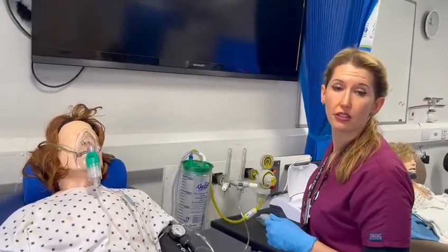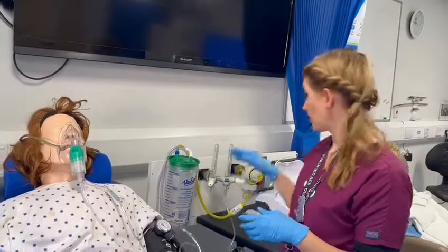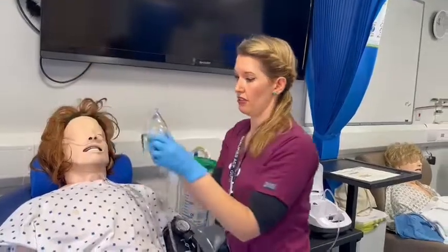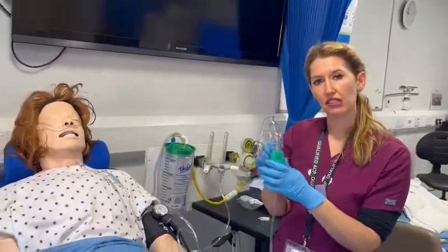Once the nebuliser is finished you can turn it off, remove the mask, and then make sure you clean the chamber at least once a day.